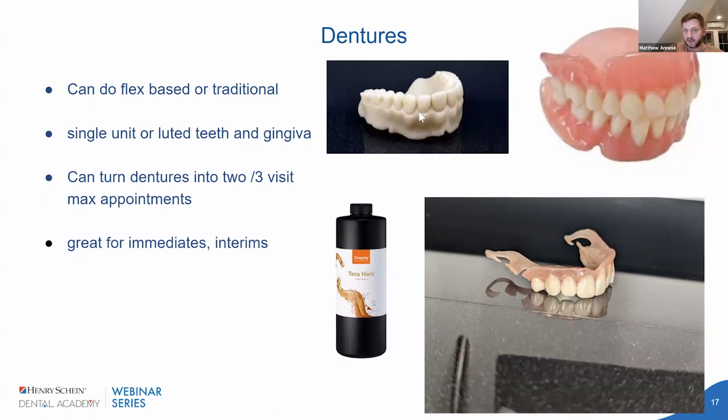We'll print it kind of like this, a single base with this, and that gives me a reference, and then I can adapt and change from there. So it's pretty cool. If you're doing dentures, I still don't think they look as great. I've seen some that get really into it that look as great, but as a pressed acrylic. But you can do it single unit.